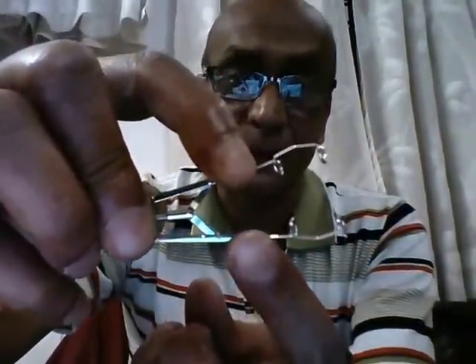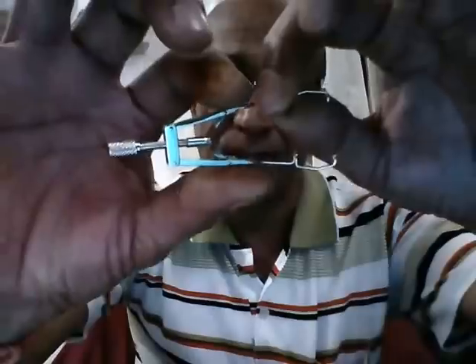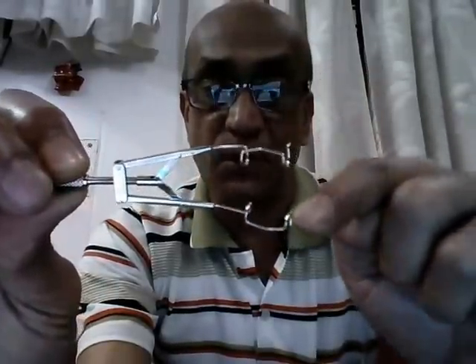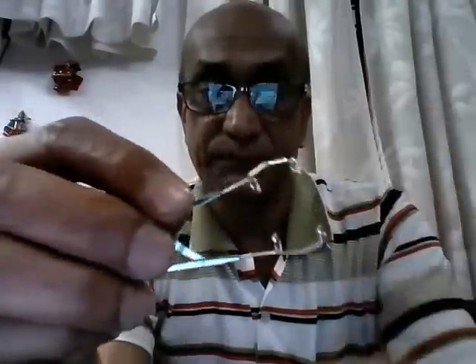This speculum is universal — it can be used in either eye by simply turning it. There is a small angulation which goes over the orbital margin, and the adjustable section controls the width of separation. One drawback is that once the eyelids are separated, this portion is unguarded, meaning the eyelashes can peep into the operating field during surgery.